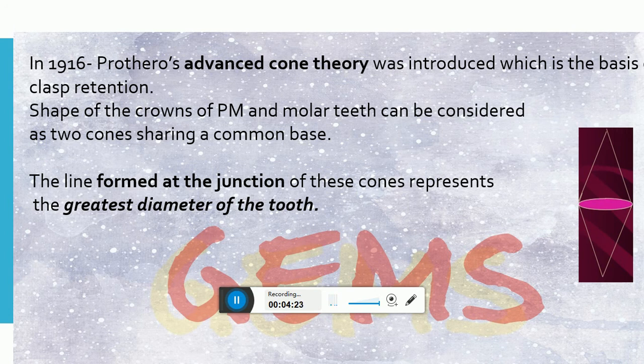Next, we have extracoronal direct retainer class. Okay, what is this? It consists of components that reside entirely outside the normal clinical contour of the abutment. They serve to retain and stabilize RPD. Two distinct categories are there: extracoronal attachments and retentive clasp assembly only. The extracoronal attachment was first introduced by Henry R. Booth. Okay, but it is not important who gave this. And it was modified by Roach.